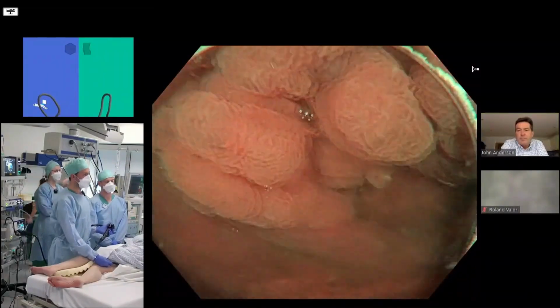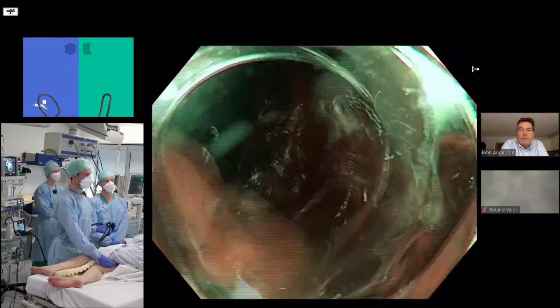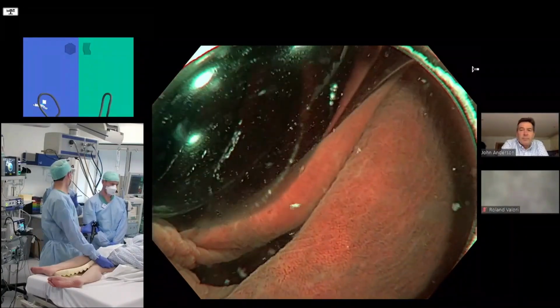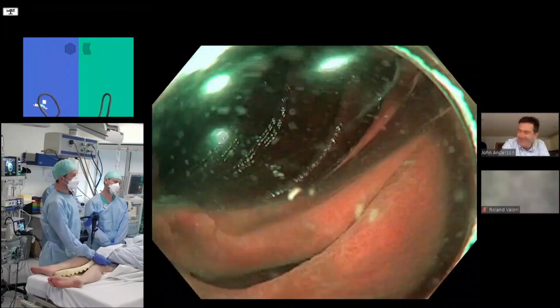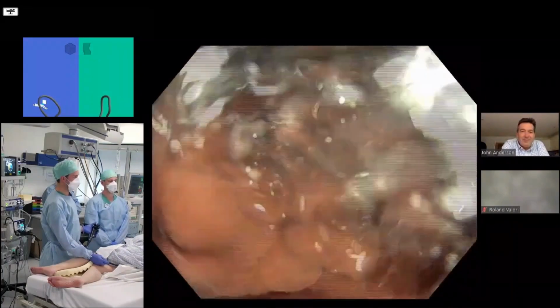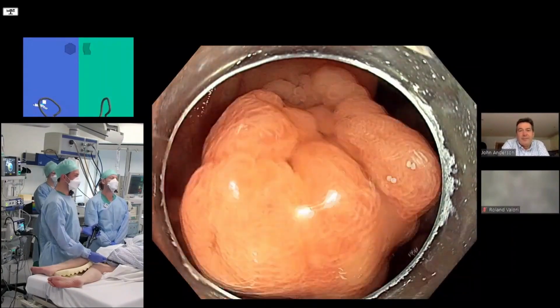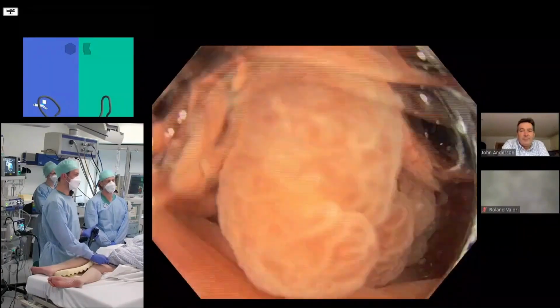All right. So I think this is a nice one. Just to remind me, how much colonoscopy polypectomy experience have you got? Hot snare, like 20 to 30, so not that many. All right. So we've got 2 people in the room, and I'm making a judgment about who's going to make an imprint on this. I know Zander's skills relatively well, and I suggest that we mix it up a little bit. I'm not sure either of you is going to be able to complete this, but I would suggest that we can get you both doing a little bit of this.